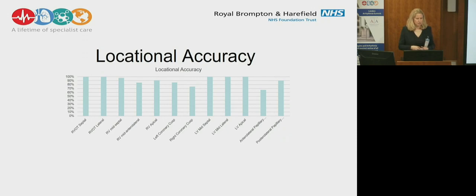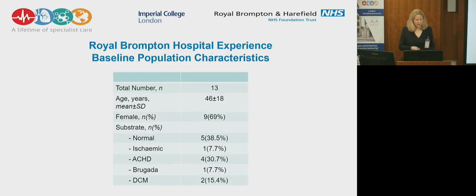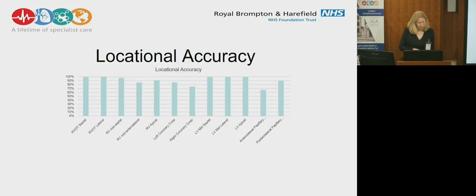Now, if you look here through the different areas of the heart, then you can see that for some areas, the critical, difficult area still is the right coronary cusp. Again, if you think about where it actually is, there's such a crossover still with the right ventricular outflow tract, and you would say, okay, that's what we learned. We would map probably the right ventricular outflow tract, and if it's not from there, and we're not really early there, we would go anyway now to the anatomically opposite side in the right coronary cusp. But I think that is still pretty good.